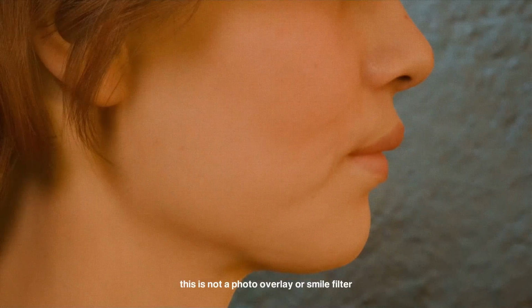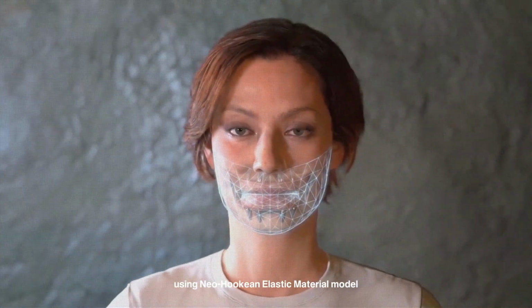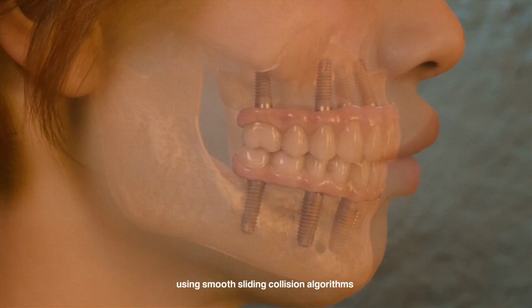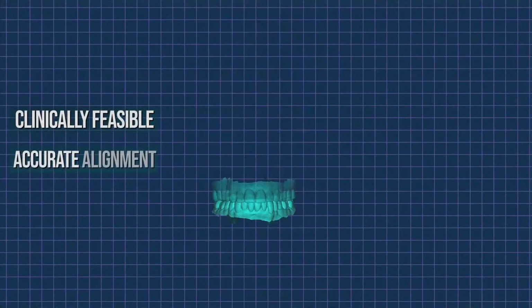This is not a photo overlay or smile filter. Soft tissue is modeled biomechanically using a neo-Hookean elastic material model with standard parameters. Contact between tissue and prosthesis is computed using smooth sliding collision algorithms, and the simulation runs iteratively until equilibrium. What they show is that this workflow is clinically feasible, alignment is accurate, and patients can preview outcomes before treatment even starts.